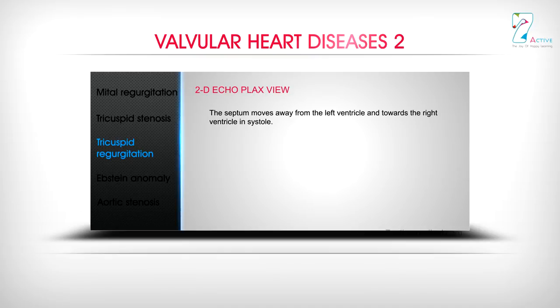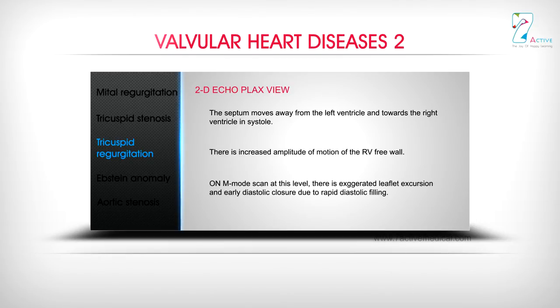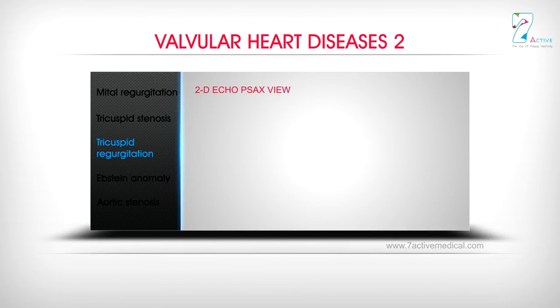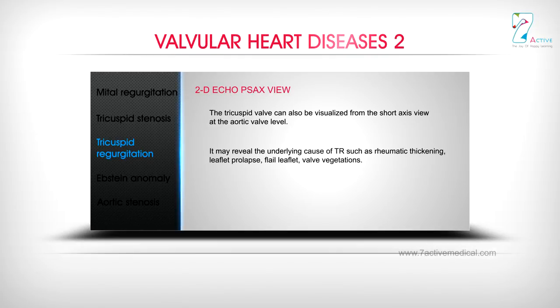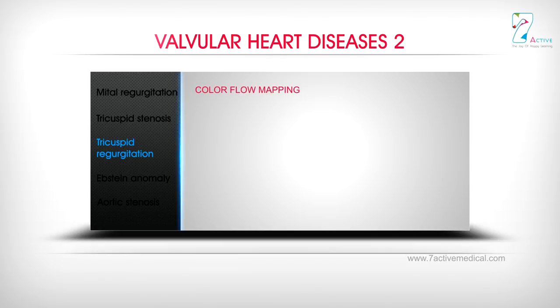2D Echo PLAX View: The septum moves away from the left ventricle and towards the right ventricle in systole. There is increased amplitude of motion of the RV free wall. On M-Mode scan at this level, there is exaggerated leaflet excursion and early diastolic closure due to rapid diastolic filling. 2D Echo PSAX View: The tricuspid valve can also be visualized from the short-axis view at the aortic valve level, which may reveal the underlying cause of TR such as rheumatic thickening, leaflet prolapse, flail leaflet, or valve vegetations.